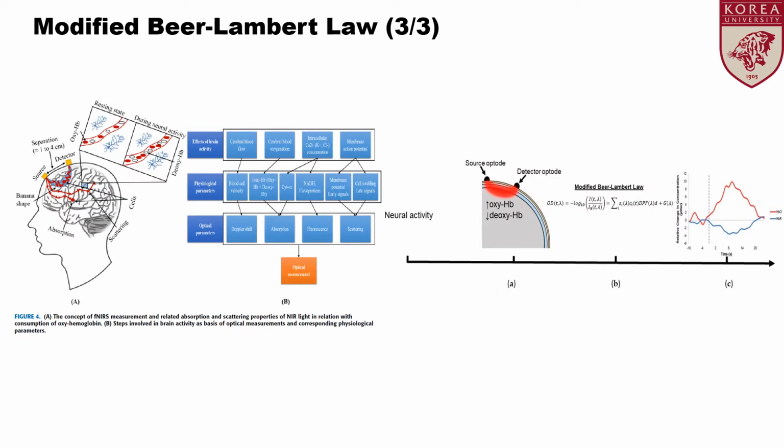The basic concept of NIRS is when we do some activity, it is a well known fact that the brain requires more oxygen in comparison to rest state.